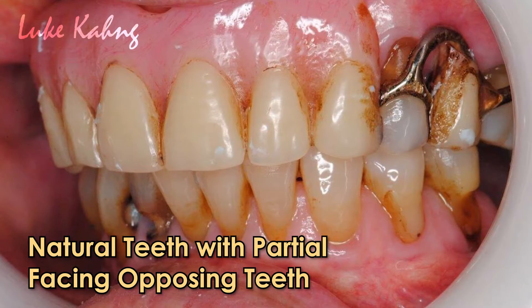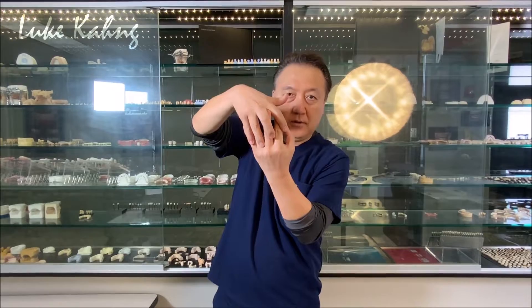Problem number two: if a patient has natural teeth on one side and a partial on the other, this is even worse. Whenever natural teeth hit first, the partial side takes all the force — especially on long-span bridge areas — and they keep hitting constantly, especially at night when grinding. This causes micro-cracks and fractures. A night guard helps but doesn't fully solve it.